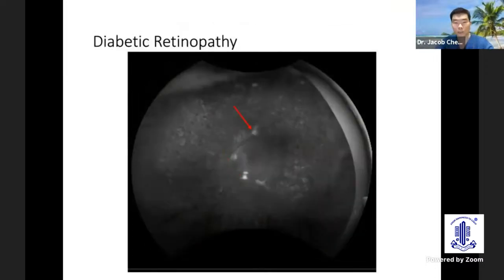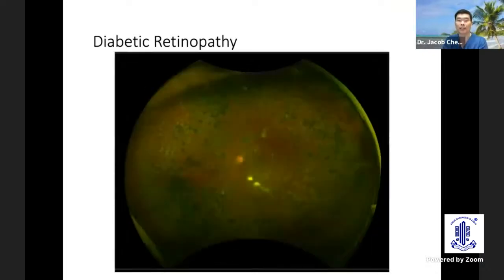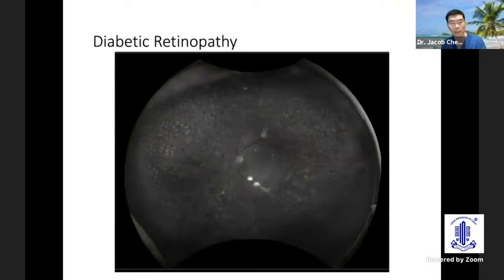So again, on the opposite eye, the pre-retinal membranes have been highlighted on the green channel, or the green laser. But also in an institution, we want to show the residents the areas of insufficient or deficient laser that can be topped up in this patient using the green channel. Again, post top-up laser, you can apply the green channel or green laser to show them that it has been nicely topped up.